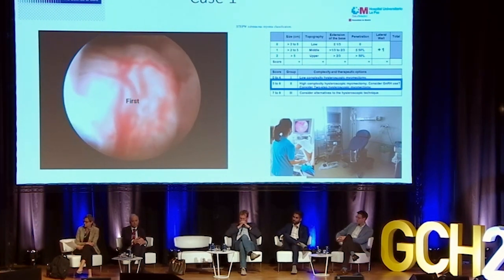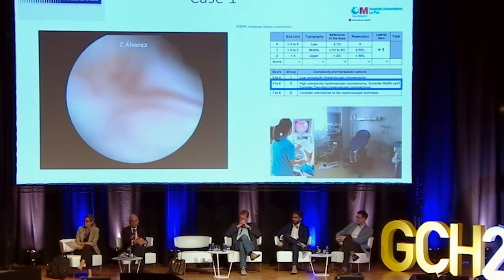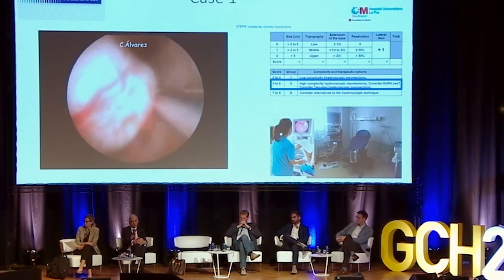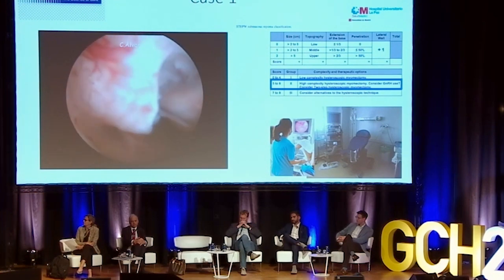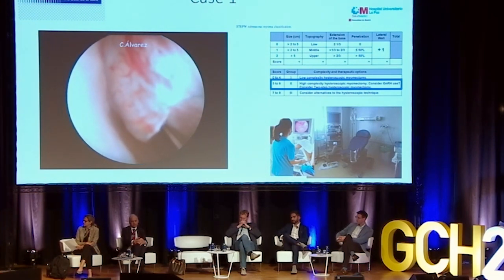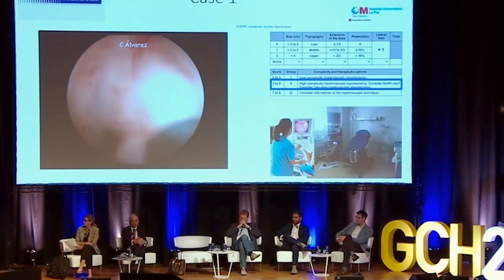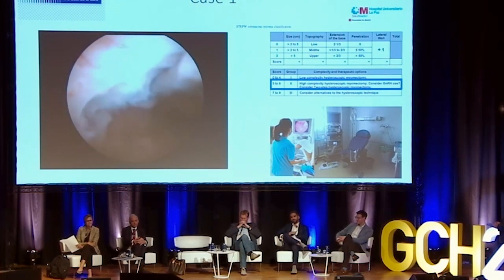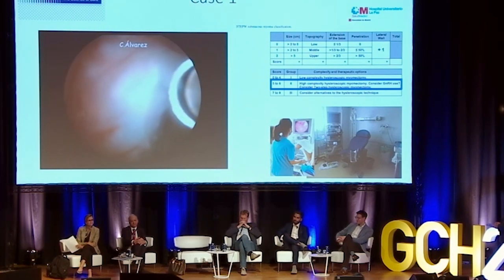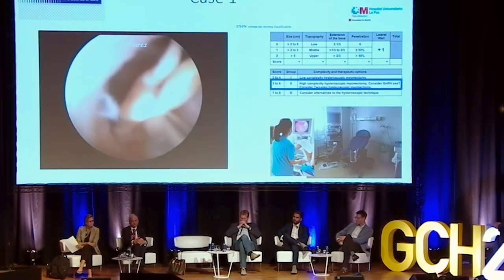As you can see, our first myoma is a type 0 myoma, 4-5 centimeters. Our goal is to separate the myoma from the uterine walls, because if we separate the myoma from the uterine walls, we could finish this myomectomy. As Jaimovich showed us in her amazing multicenter study, we could leave the myoma inside the uterus and the patient does not have any problem, any pain.